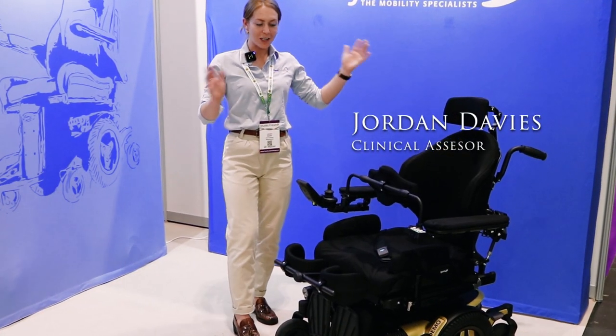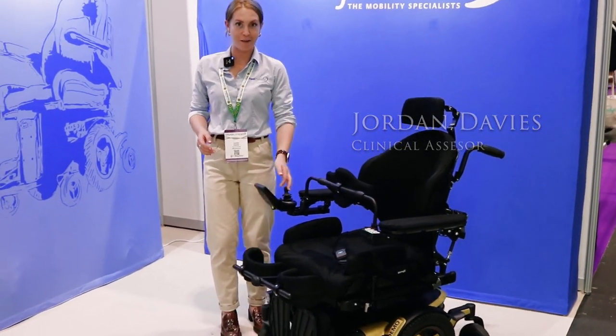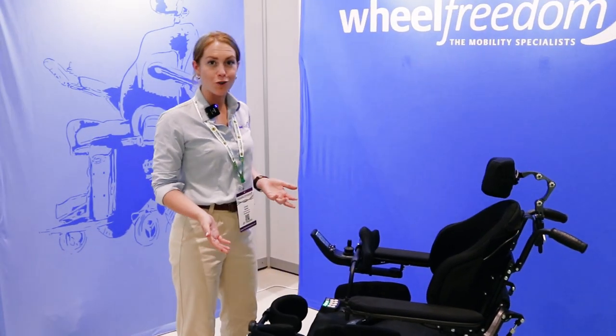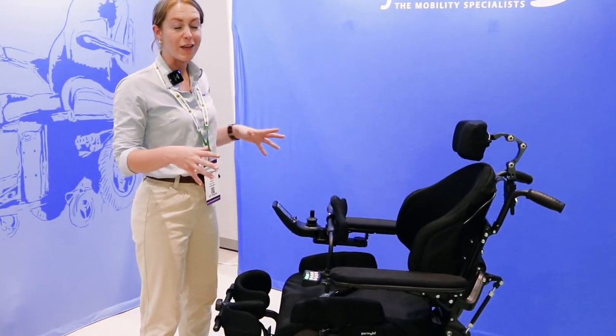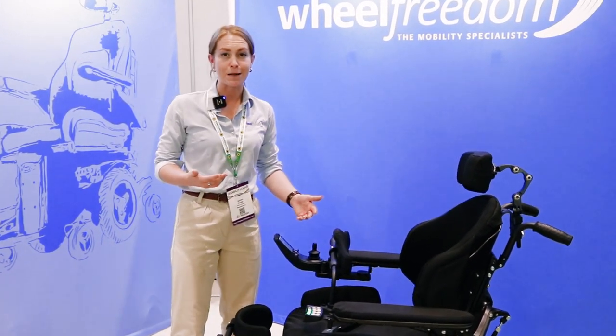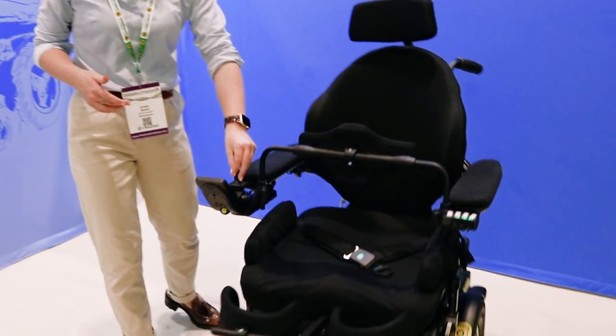This is the new Permobil M5VS. Traditionally we would have been looking at front wheel drive for a standing chair, but this brand new chair is a mid-wheel drive version, giving you the standing benefits but also that really small turning circle of the mid-wheel drive.